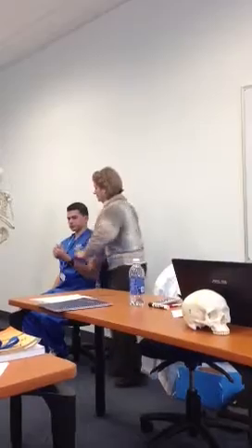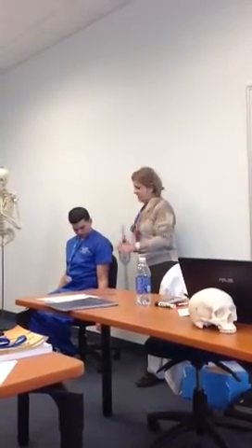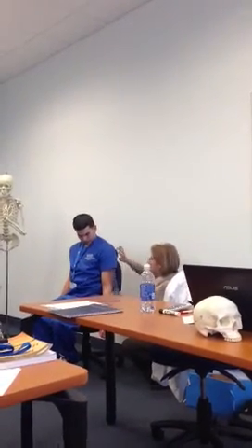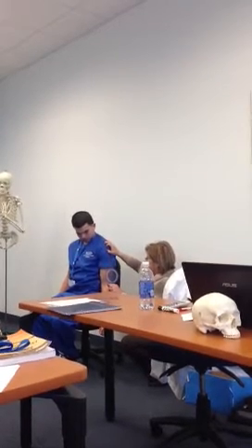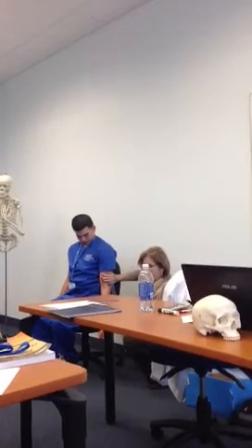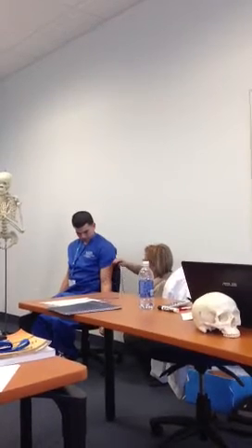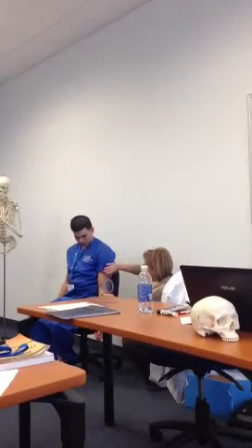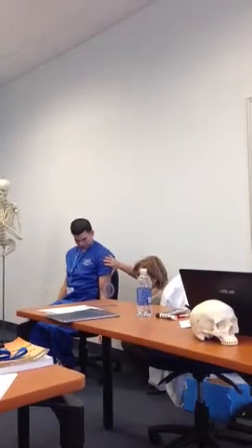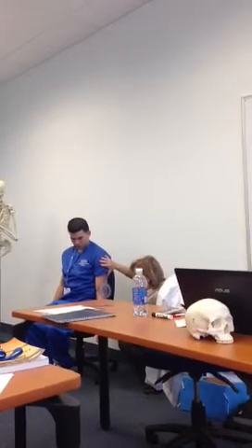Usually wrist extension. So okay, let's do elbow flexion. We start always in extension. Okay? So your stationary bar is going to be running along the humerus, which is the one that is not going to move because you're moving this guy, right? The forearm. So what plane and what axis? Sagittal plane, frontal axis. Correctamente.